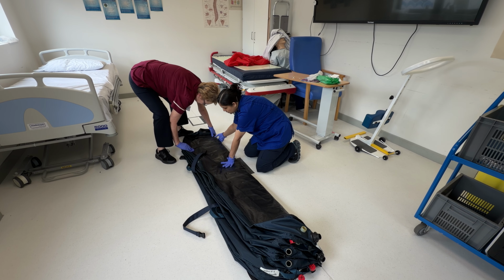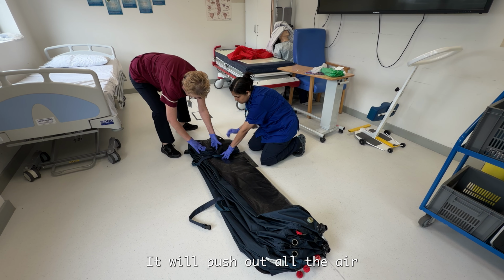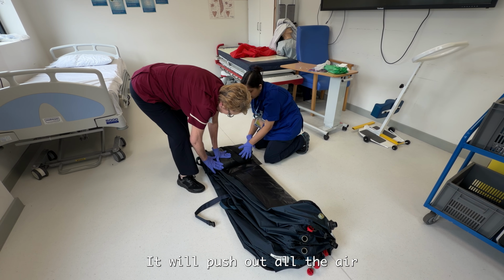So we are going to start folding it. We'll push out all the air that is left in the mattress.